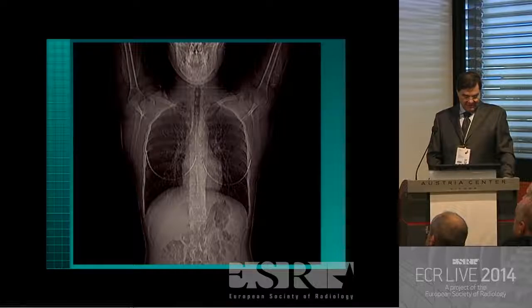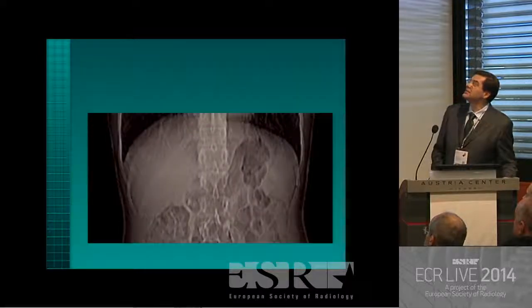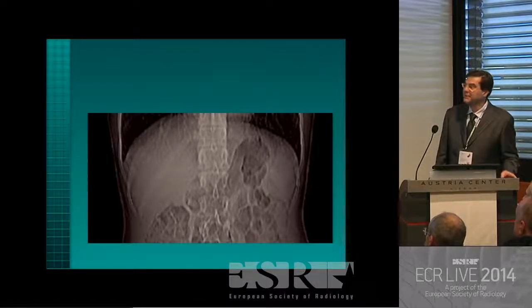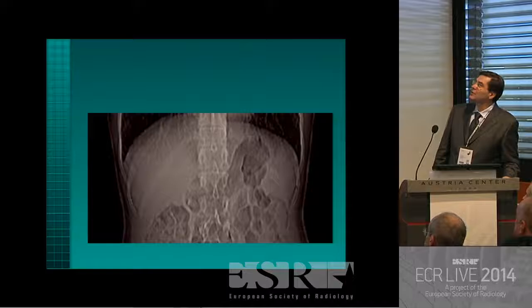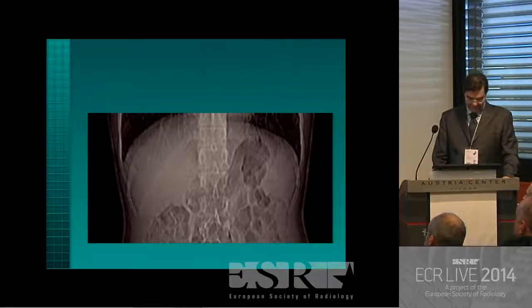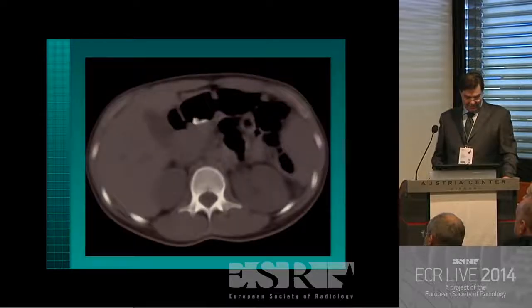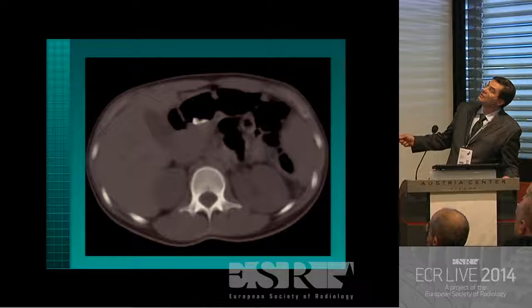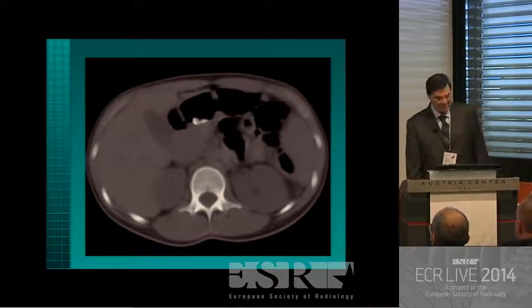And last, a 10-second quiz case, a patient who had swallowed a tooth during an investigation. And I hope you can see the tooth in the topogram, which was searching for it if it was aspirated. And if you look quite clearly at it, you can see it here, paravertebral in the duodenum, and here you have the tooth, and you can even see that there is a carious lesion in the tooth. So it was the reason why it was extracted.